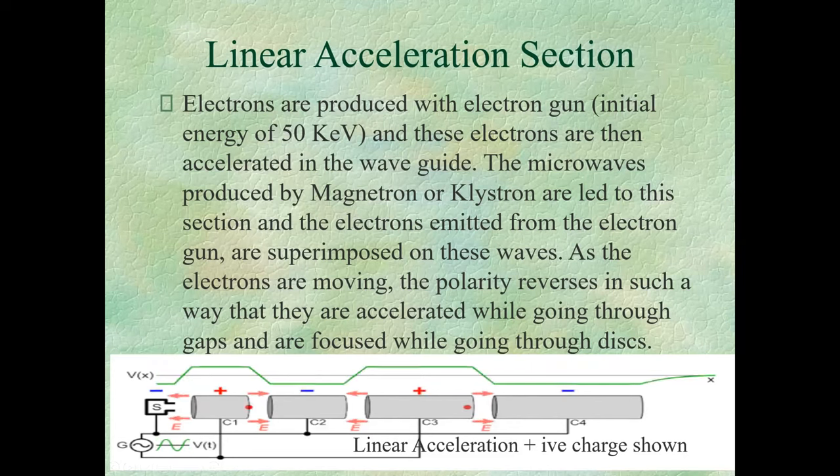And here are the FFF beams, as we talk again. When we have the flattening filter and the beam strikes it, we get a completely flat beam.